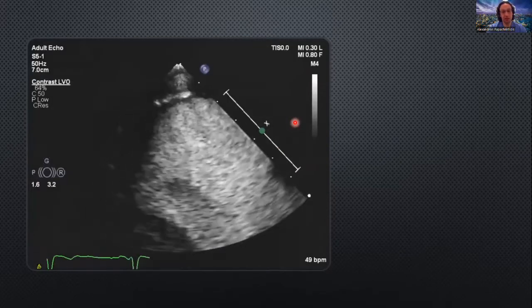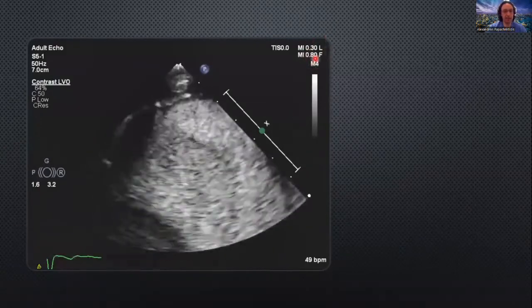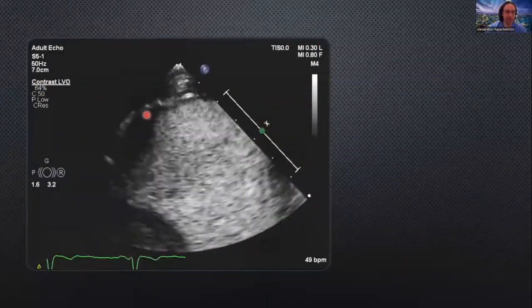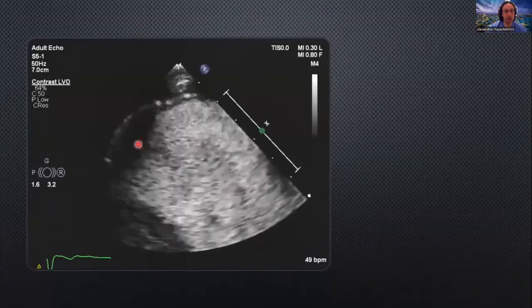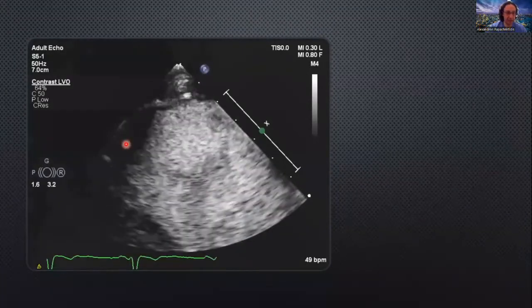So this is a not bad opacification, despite the mechanical index of 0.8 being quite high. The gain has dropped to 64%. The focus is where it has to be. And I would say there's something different here now, coming from the previous case we saw. One could say that this is a challenge, but I doubt it is.